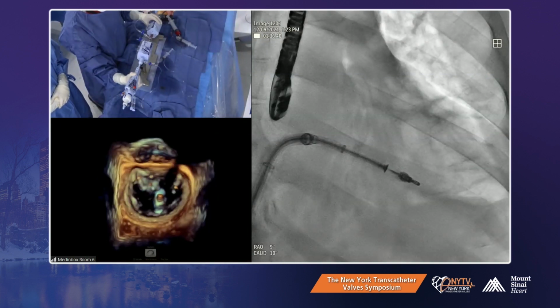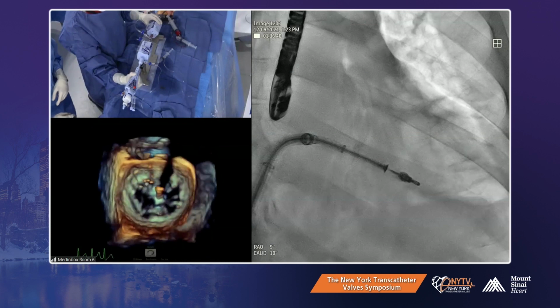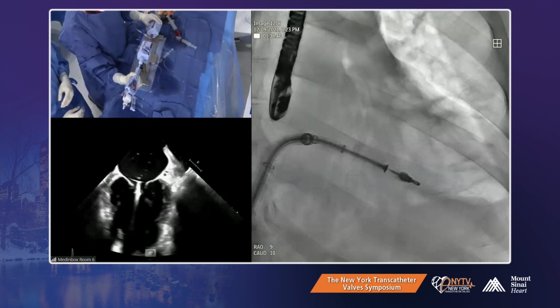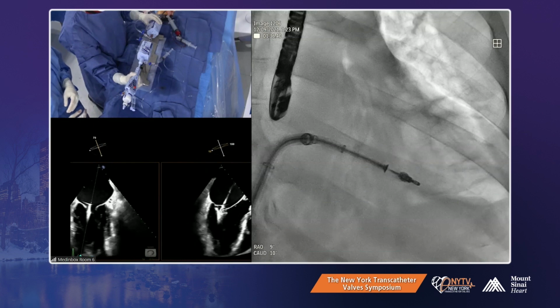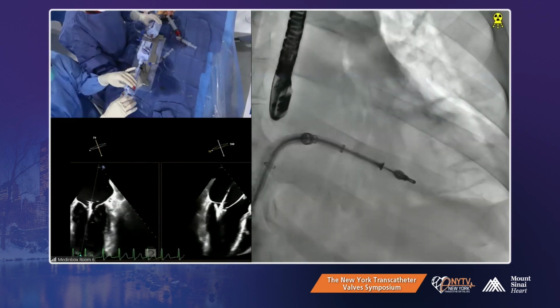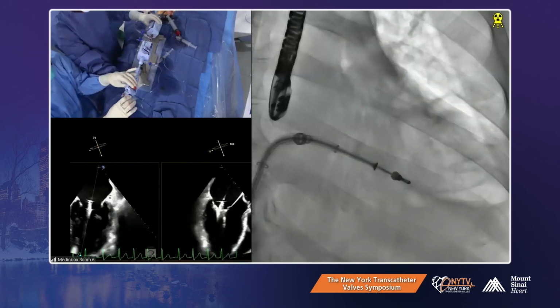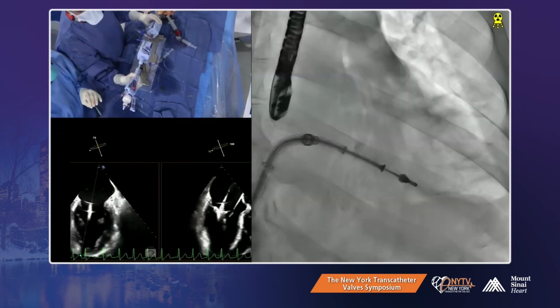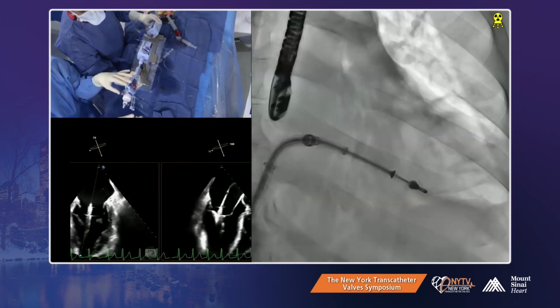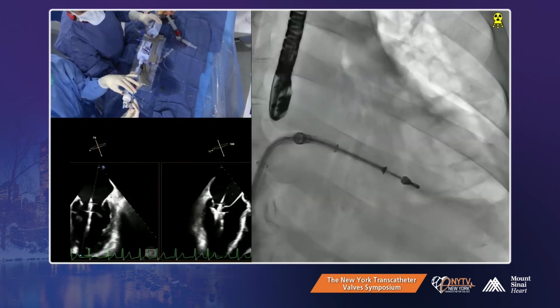We're going to bring Howie to the panel as well. Why is the heart rate so fast? I would counterclockwise the clip a tiny bit, right? Okay. Orientation is good, so we just come up.